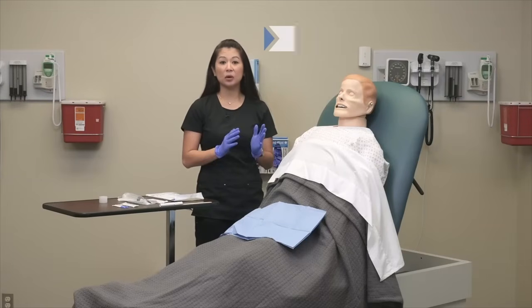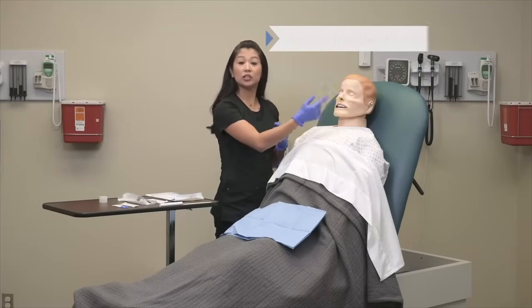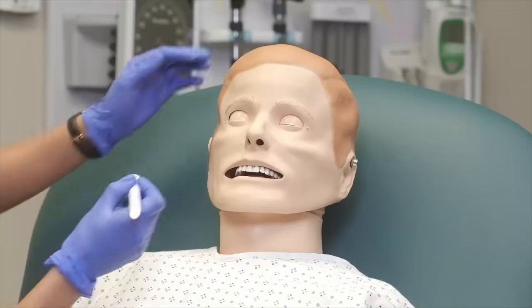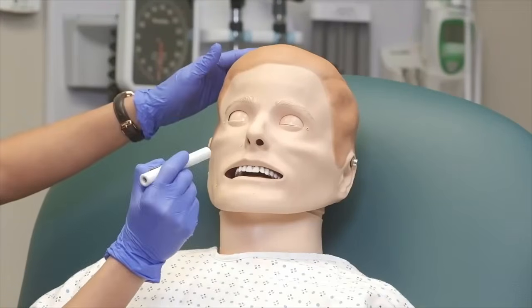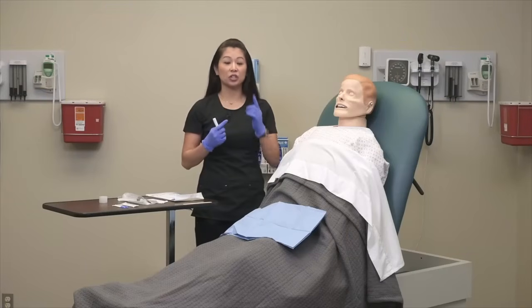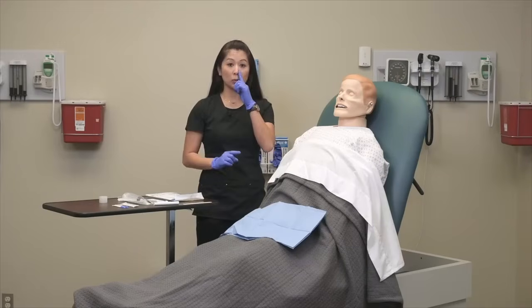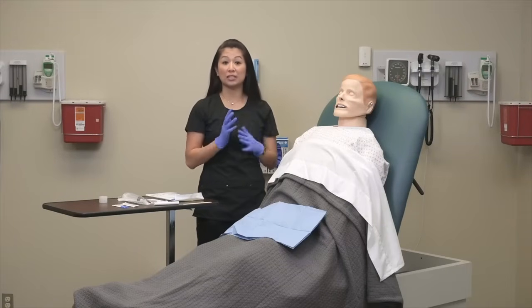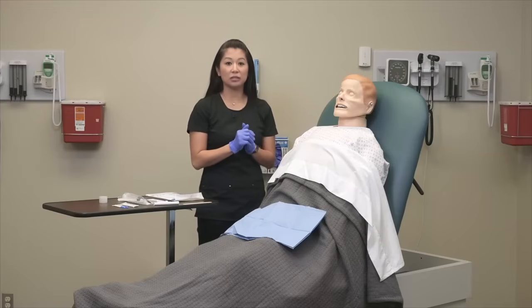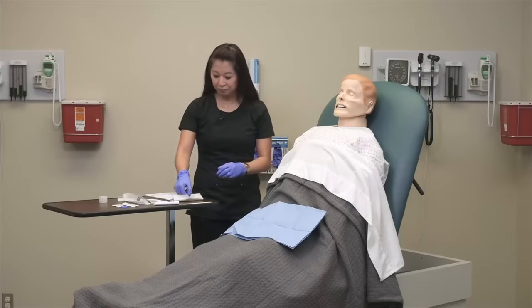All right, so next let's go ahead and assess the client's nasal cavity. When I do this, I'm going to look at each nostril of the patient. You can even take your pen light, for example, and take a look up there. Ask the patient if they have a deviated septum or any issue on one side or the other. The other thing you can do is have the patient close one nostril and blow and see which one has a stronger airflow. Once we've assessed the patient's nasal cavity, I'm going to determine the insertion length of our nasogastric tube.